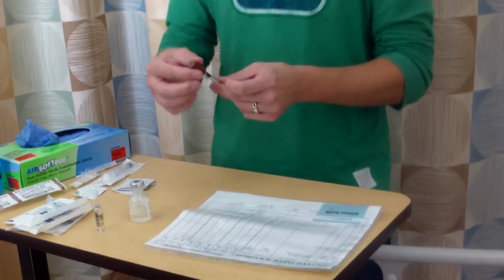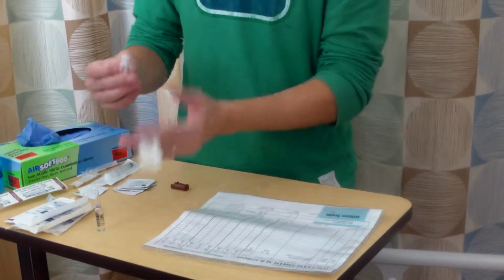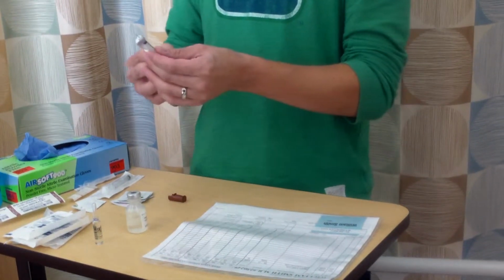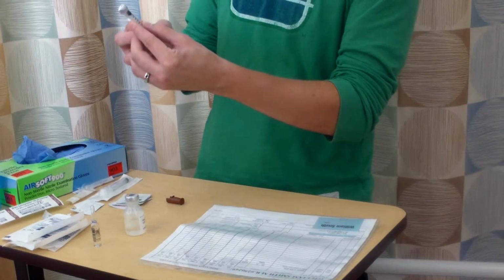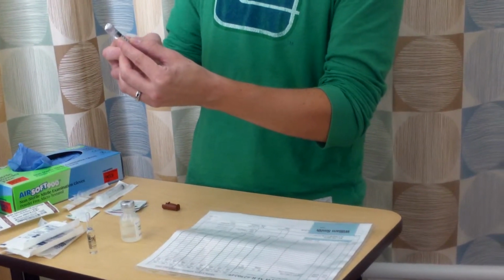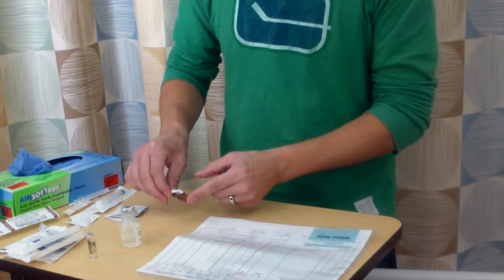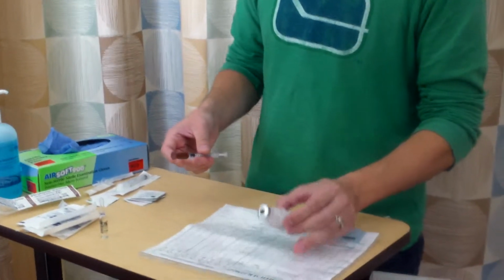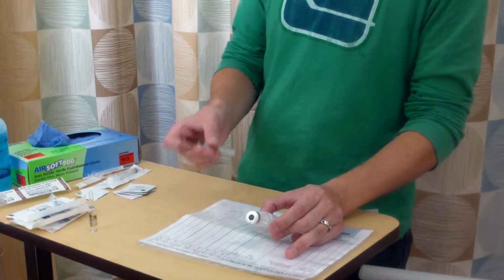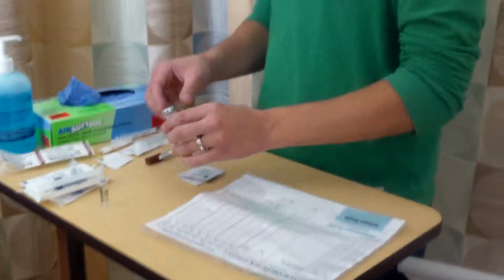So I have that, so then I would uncap it, stick it, push the air in, invert it, and then withdraw the medication. But because of this, I need to have air to withdraw it in the specialized pad. So I'm just going to make sure I have 0.25 mils of air in there. I will cap that, and make sure that that was the appropriate medication, doing my second check. I have the right amount, the right medication, and it matches up. So that's good. I'll set that aside.